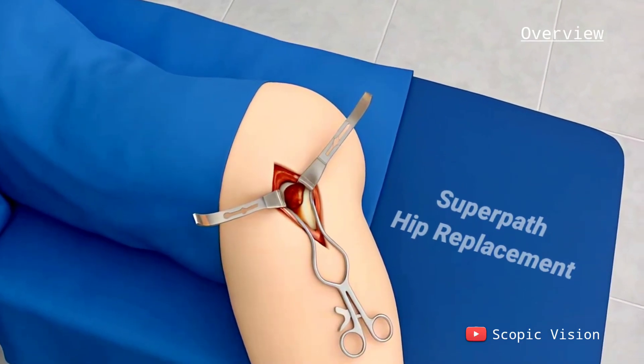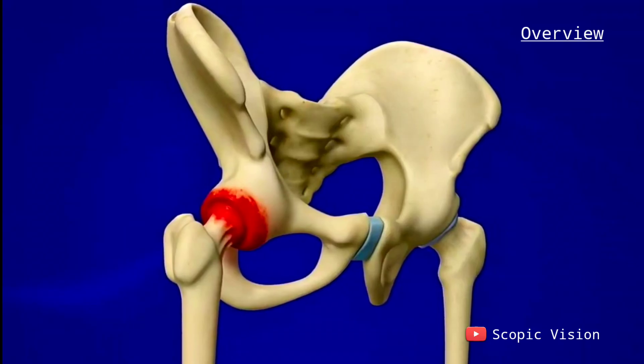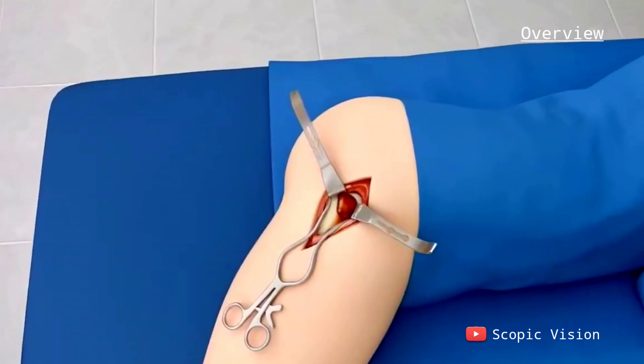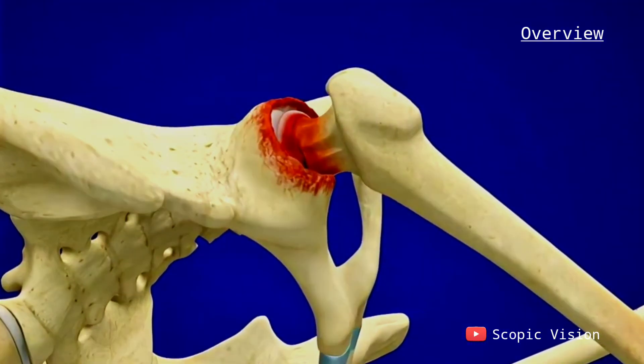SuperPath hip replacement is a type of surgery used to fix a damaged or arthritic hip joint. It has some advantages over regular hip replacement because it lets doctors reach the hip without cutting any soft tissues. Sometimes a tendon might need to be moved, but it's usually fixed at the end.